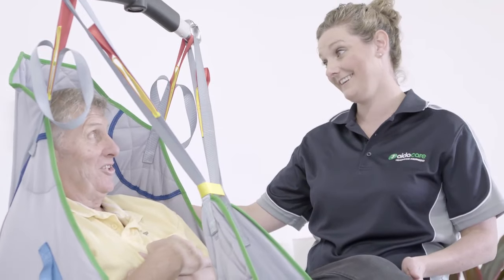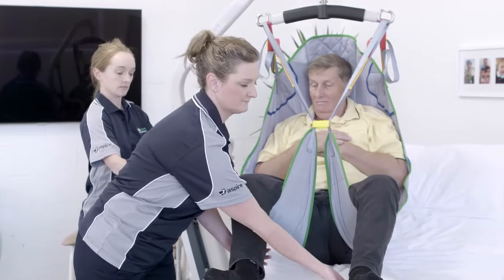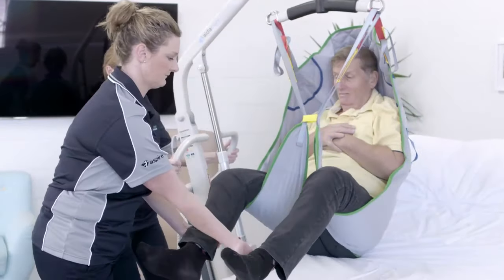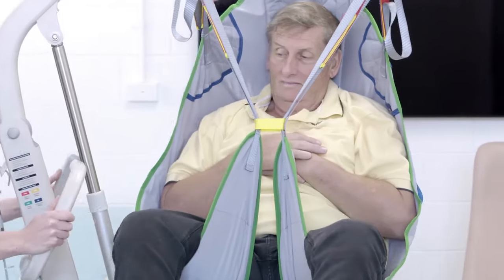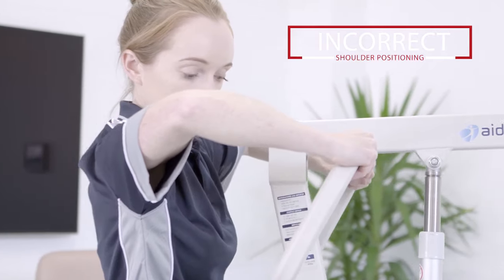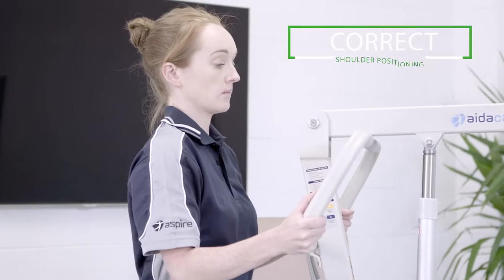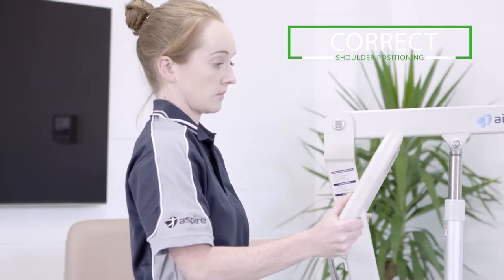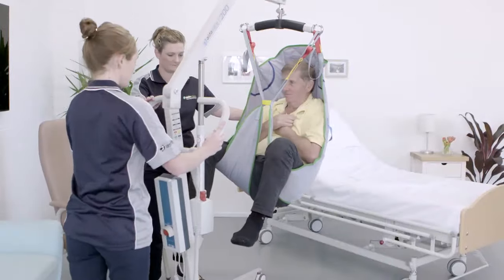Remember to constantly communicate with each other. Lift the resident just high enough so that their bottom will not drag on the mattress during the transfer. When moving the lifter, don't forget your safe manual handling practices. This is an example of an unsafe way of moving the lifter, putting your shoulder at risk. The shoulder joint is one of the most commonly injured body parts when moving and handling residents. Protect yours by keeping your elbows by your side and below shoulder height.